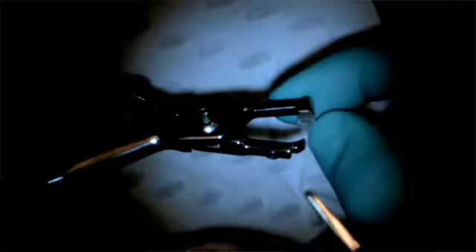This is the band remover, and you can see the plastic tip insert at the end. That's important in that we're putting a fair bit of force onto the plastic. If you have the metal there, there's more likelihood of that acrylic cracking.